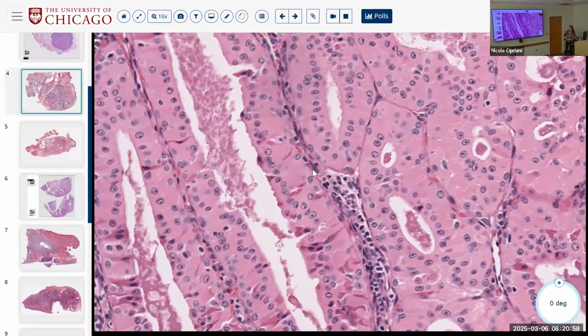And in fact, the parabasal layer is P40, P63 positive in Warthin tumors. So one could almost consider this to be biphasic also, but it's morphologically monophasic, right? Because it's all oncocytes, but immunophenotypically the basal oncocytes are P63, P40 expressing. So if you are concerned, you could use that to highlight that epithelial bilayer.